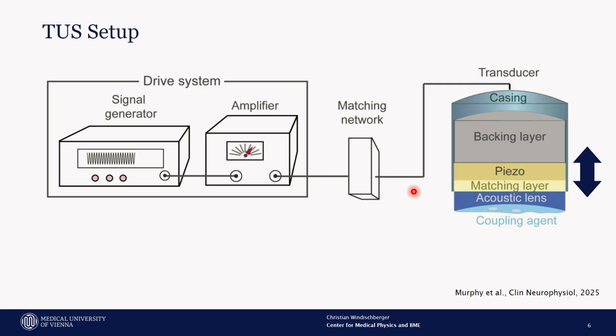So this is a special material. When you put electrical voltage on it, it will simply change its size. Right? And by using the amplified ultrasound signal, you then have also a change in this piezoelectric element, and this will produce the ultrasound waves that you're using.